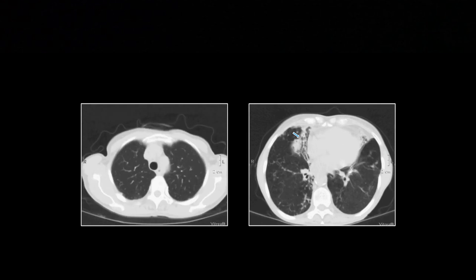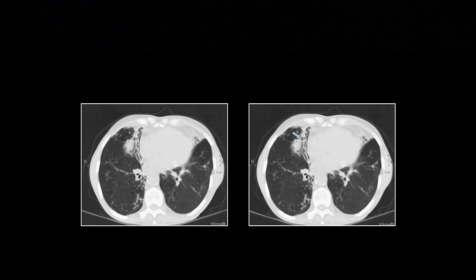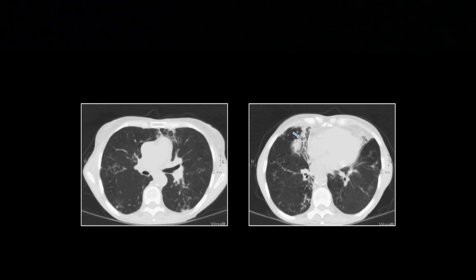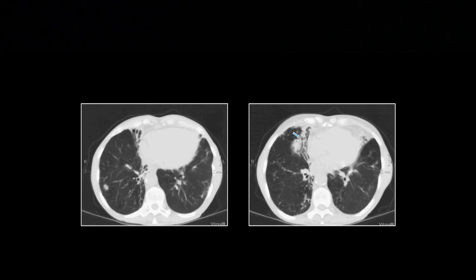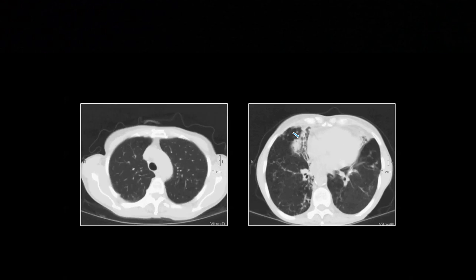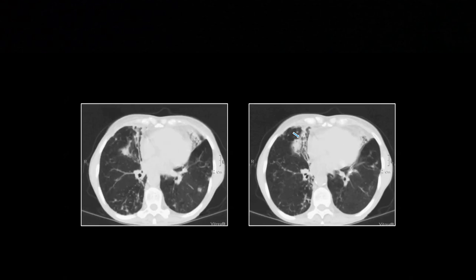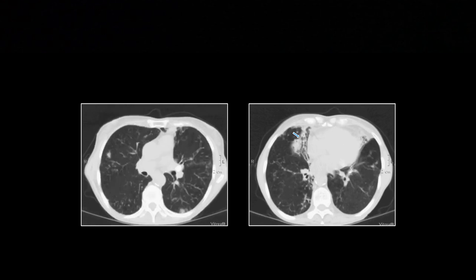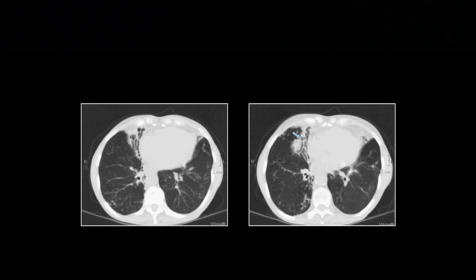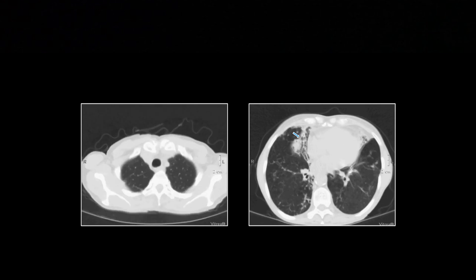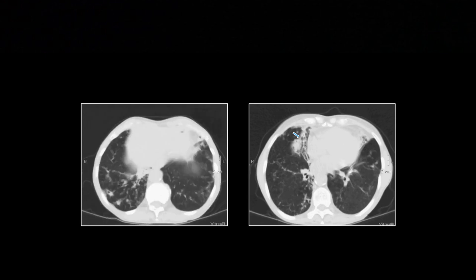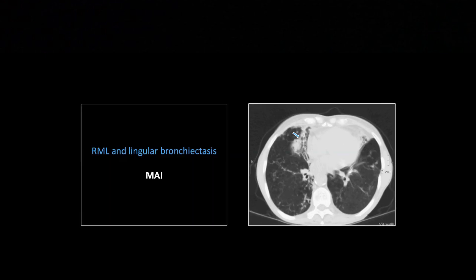There are other nodules throughout the lungs. Don't forget TB is a classic fooler on PET scan — it'll be very hot. I had an MAI patient with upper lobe nodules without classic bronchiectasis whose SUVs were 12, and I said this has to be tumor — and of course it wasn't. I was asked by oncologists: what's the number where you know definitively it must be tumor? Sadly, there isn't one. These foolers can look exactly like tumors on PET. That is the Lady Windermere finding — chronic MAI.